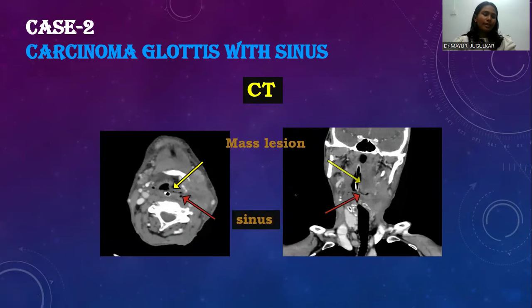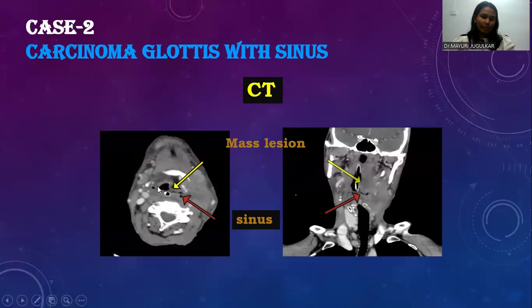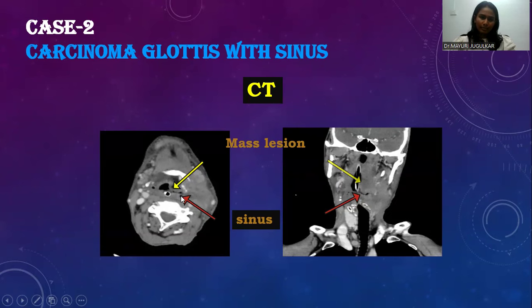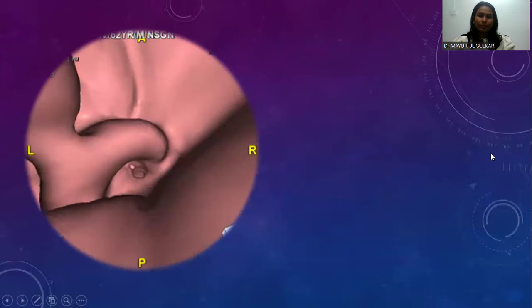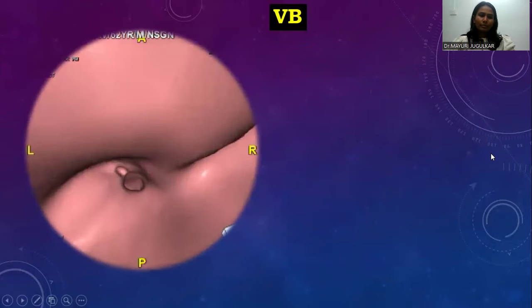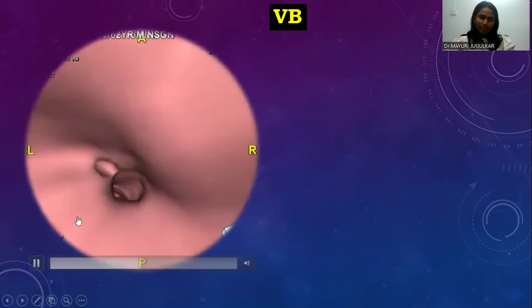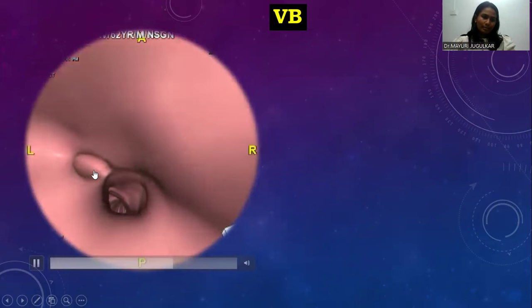Moving to the next case: a 65-year-old male complained of unexplained hoarseness of voice. CT neck suggested an ill-defined mass involving the vocal cords and anterior commissure. A blind-ending sinus is seen within the mass. This is the mass, and this is the sinus tract.